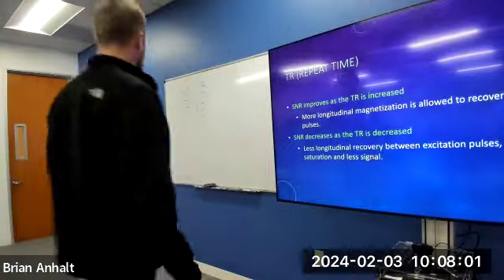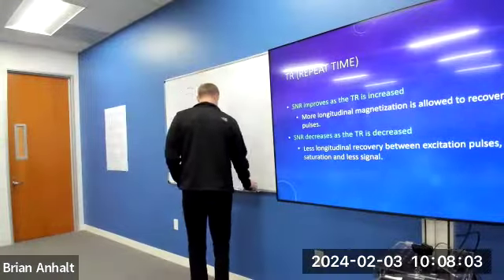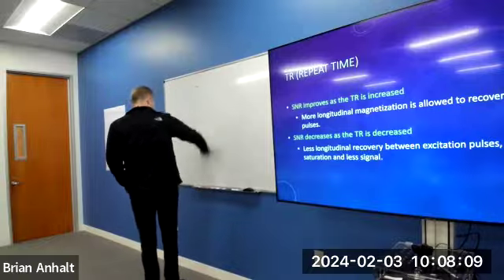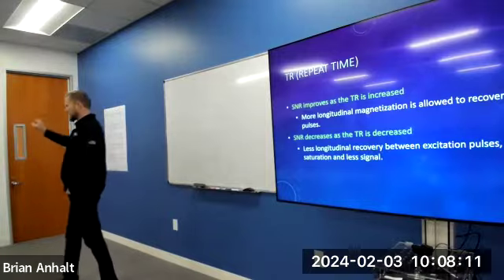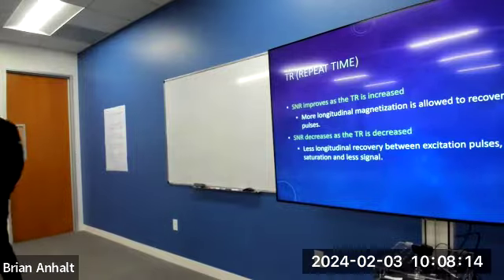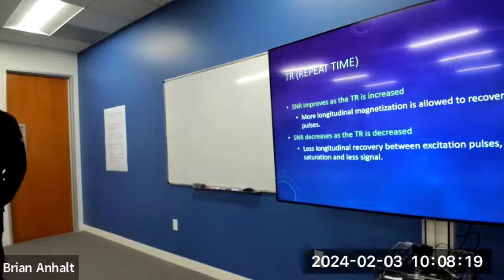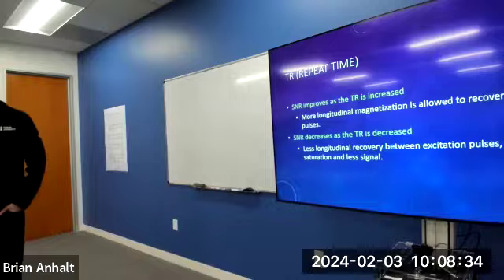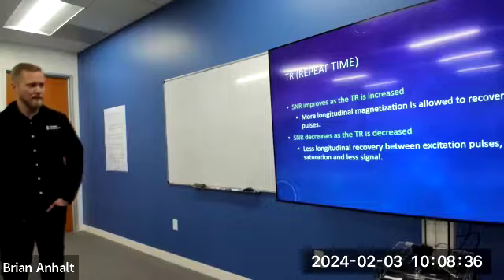Those are all the easy ones. Now we start getting into the trade-offs. And like I mentioned before, I would have that triangle out of SNR, resolution, scan time, and I would also put contrast on there. And I would put certain artifacts as well, right? So the big three are SNR, scan time, resolution, but also contrast, because we know TR, TE, and flip angle affect contrast, and then certain artifacts we will talk about as well.